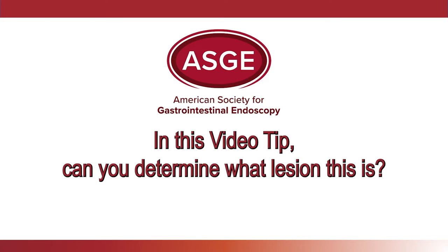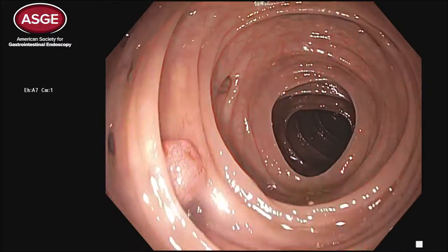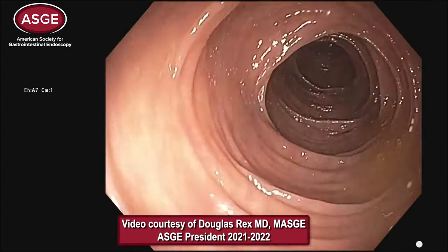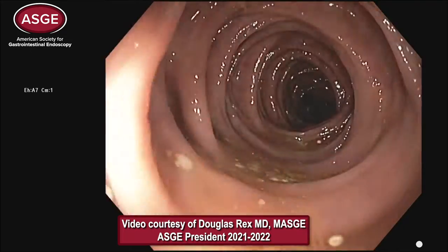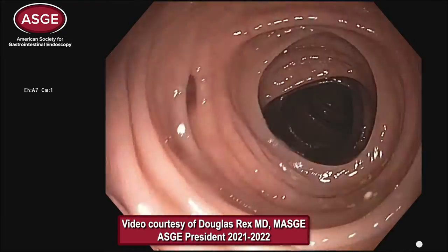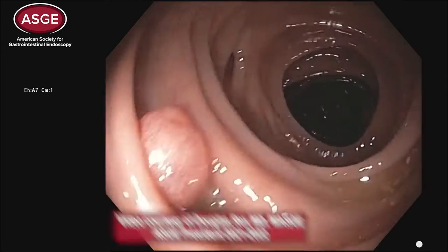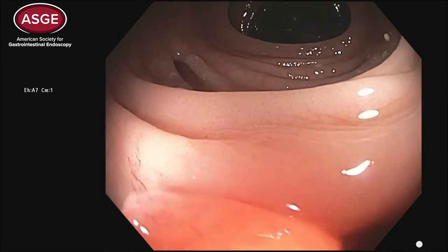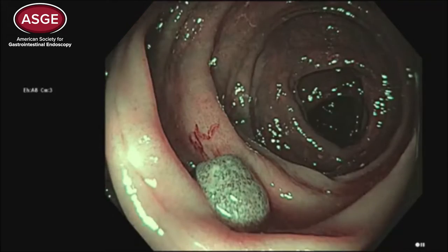Can you determine what type of lesion this is? This is a 62-year-old man undergoing screening colonoscopy. He's asymptomatic, with a polypoid lesion in the proximal sigmoid colon, seen first in white light and then examined in narrow band imaging.